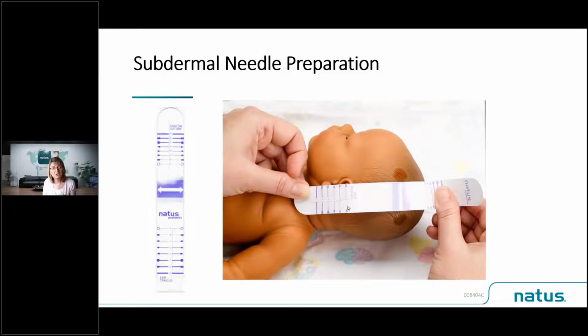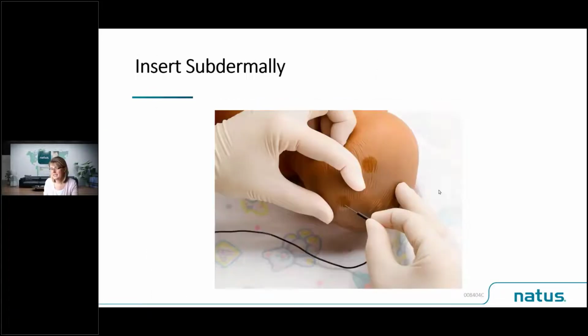You're going to do the electrode positioning in exactly the same way. So you've got your positioning aid, but you can mark your sites with your surgical marker again if you want to, and then clean with your alcohol. If you're using iodine, then you can actually mark the site with the iodine. It will show you exactly where you're going to insert those needles. So same preparation with the positioning aid, and then we're going to insert the needle. And again, I'm going to show you how to do this in just a moment on camera.